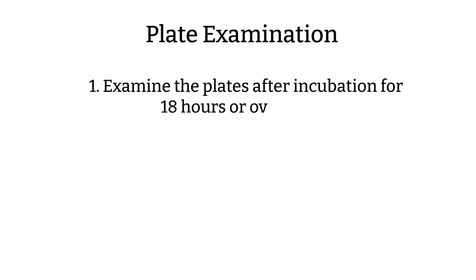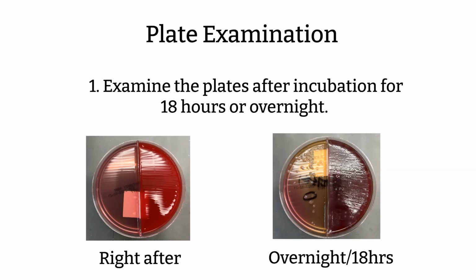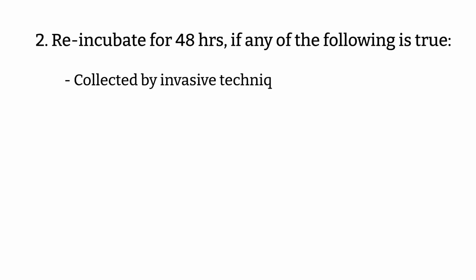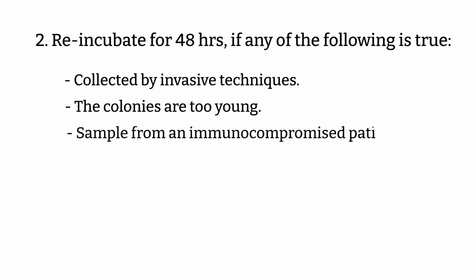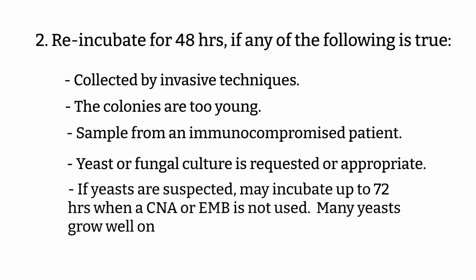Plate examination. This is when it gets exciting because you see what's going on on the plate. Step 1. Examine culture media that have been incubated overnight or at least 18 hours. Step 2. There are conditions in which we will re-incubate the plate after initial checking. Re-incubate the plate for 48 hours if the following is true.